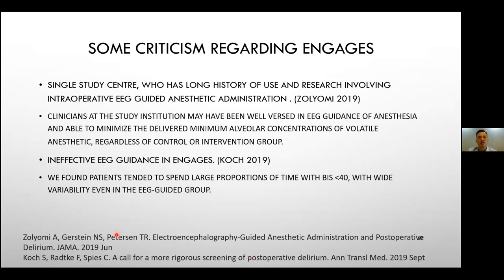The second point raised is that the EEG guidance in ENGAGES was deemed to be ineffective, as pointed out by Koch, as the patients in the EEG-guided group tended to spend a large proportion of the time with BIS less than 40. And the reasons given above might be the explanations for the discrepant results of ENGAGES as compared to the previous studies.